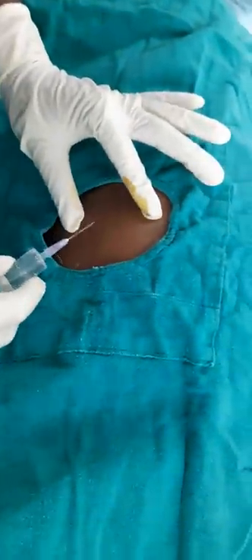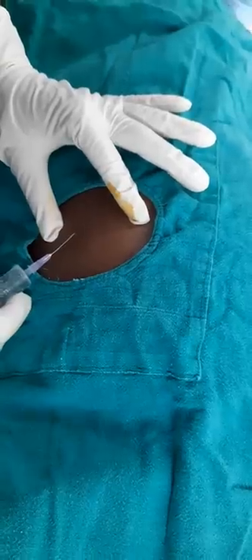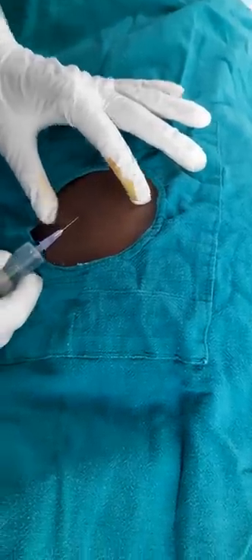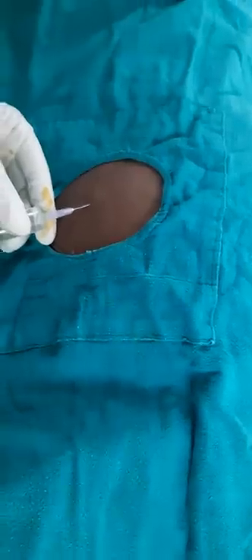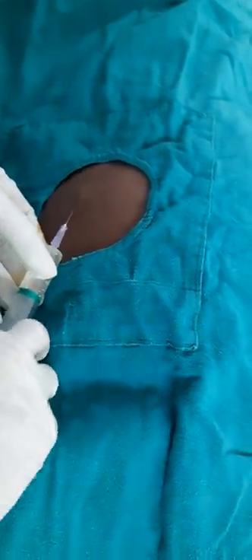Now we will apply the draping sheet — as you can see, this is the draping sheet with the aperture. Now we will anesthetize this area. Doctor, please apply lignocaine to the subcutaneous tissue first.